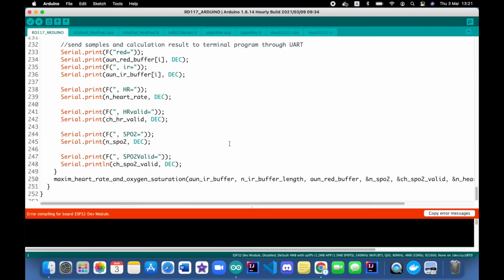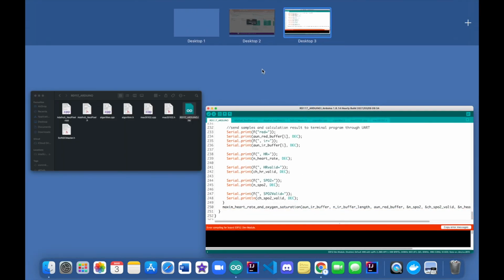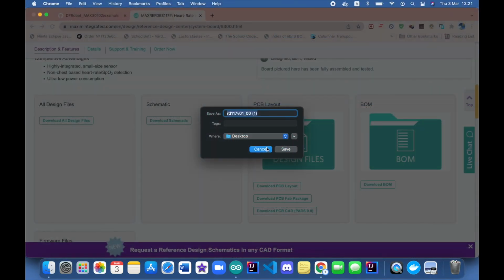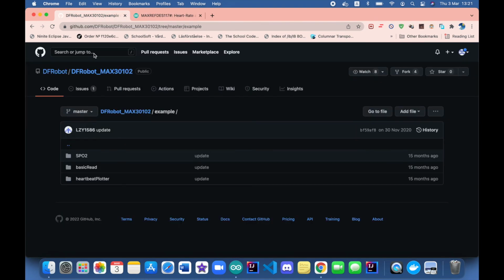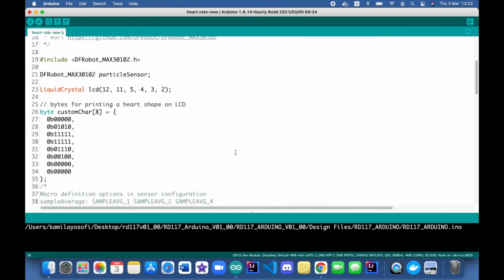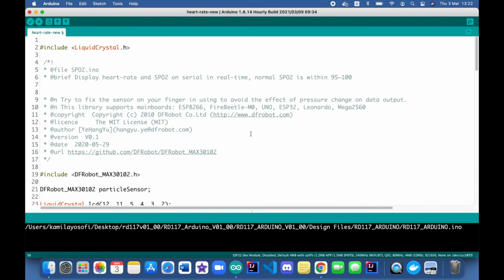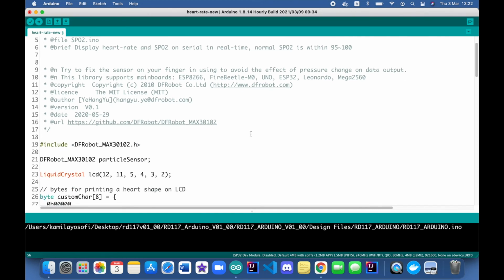There is another library as well, which you can use if you want. There are so many different links for it, but originally it's MAXrefdes117, so you can go to their website and play around with the code there as well. So yeah, this was the code for the tutorial. It's not really a big explanation, just explaining the code from the library.